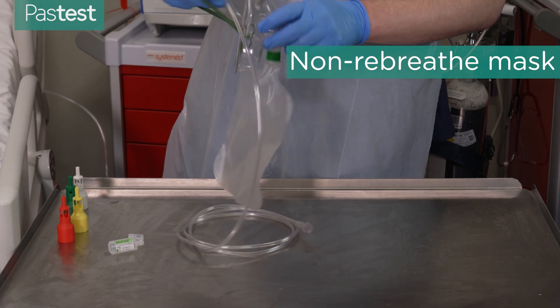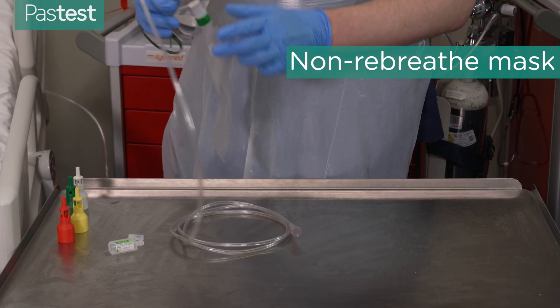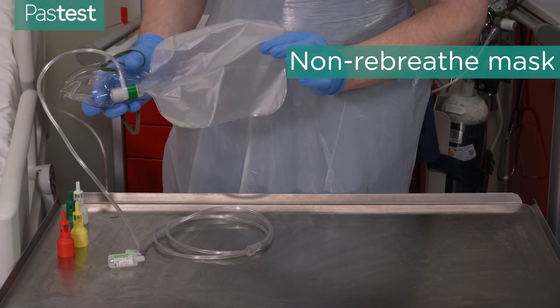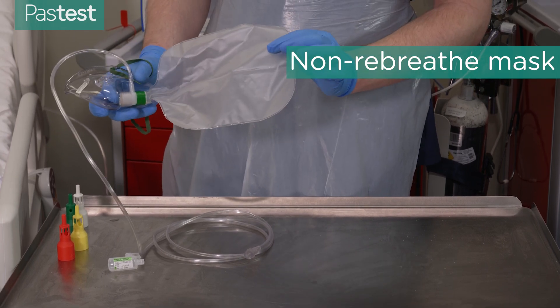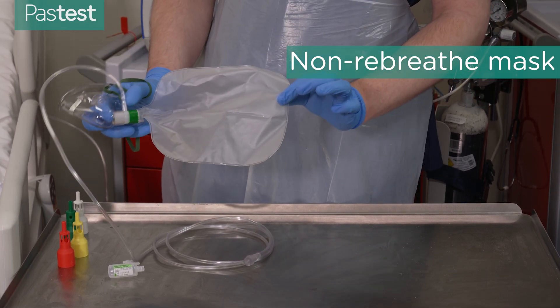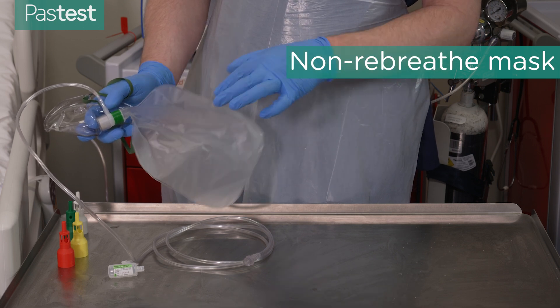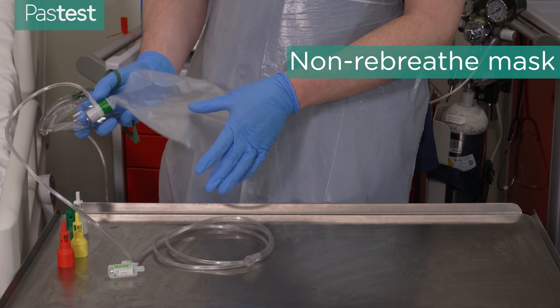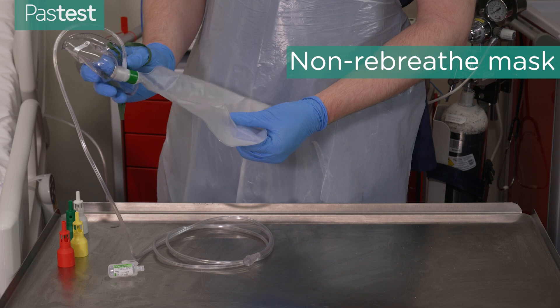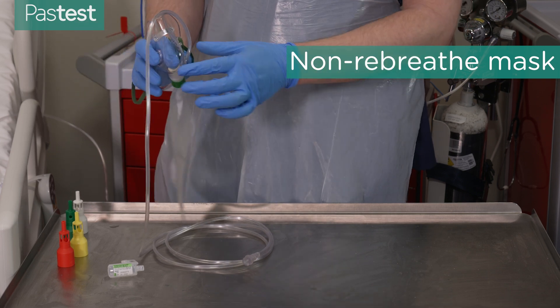Before putting this mask on the patient, the first thing to do is turn on the oxygen, cover this valve with your finger, and allow that bag to inflate — just so we know the reservoir is ready and the patient is going to be breathing a high percentage of oxygen.